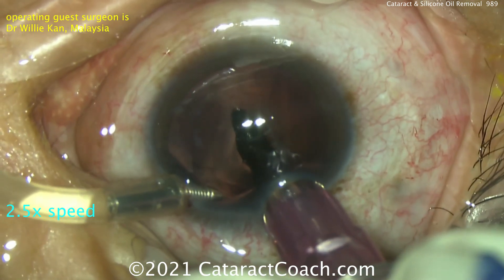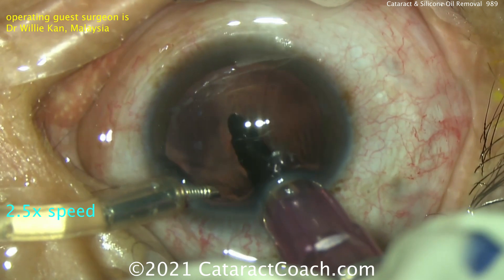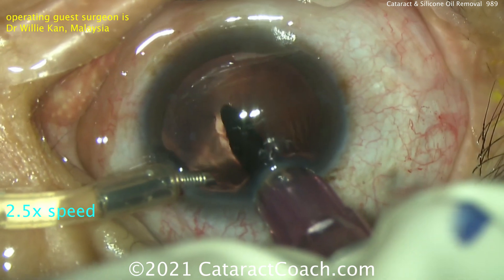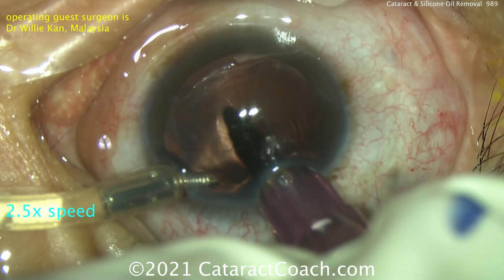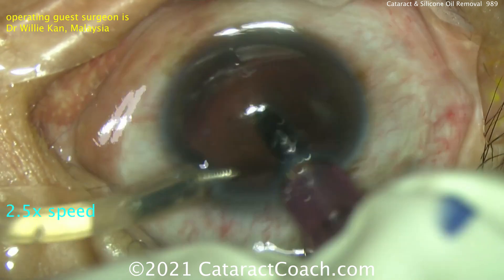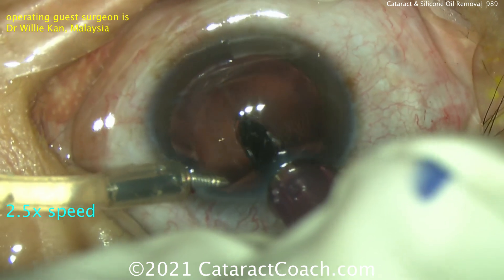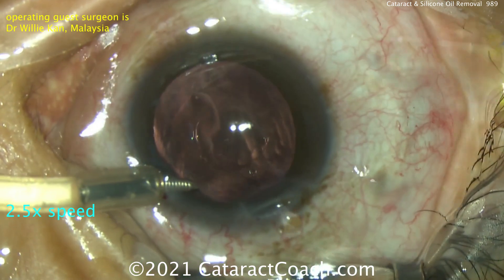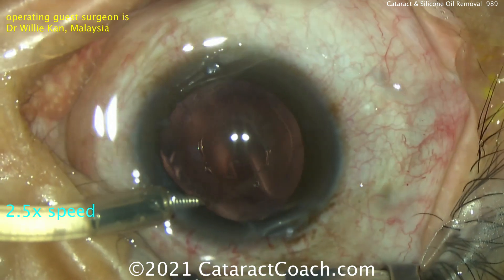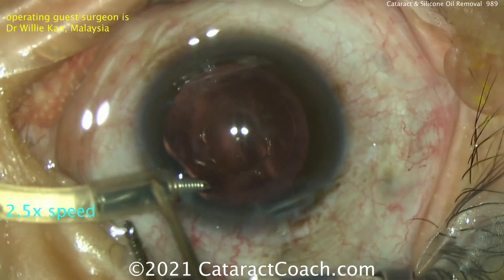You'll have to take your time and be gentle so that you don't outstrip the infusion. Remember, the vitreous cavity is much larger than the anterior chamber of the eye, so it will take a little more time — being patient here is key. Once all the silicon oil is removed, you can do a little more washout to ensure it's all gone. There's the end of the removal of this big silicon oil bubble. You can further wash out with the anterior chamber maintainer to ensure complete removal of the oil droplets.